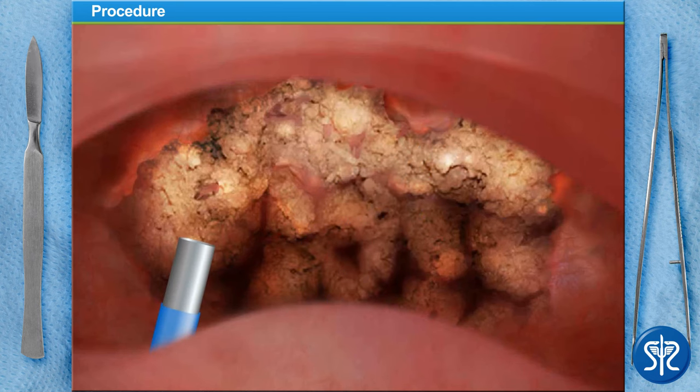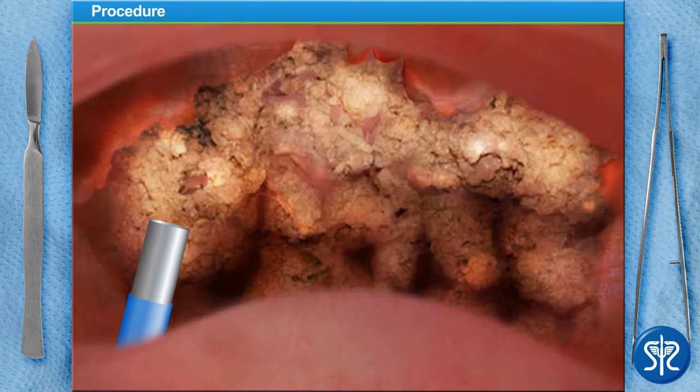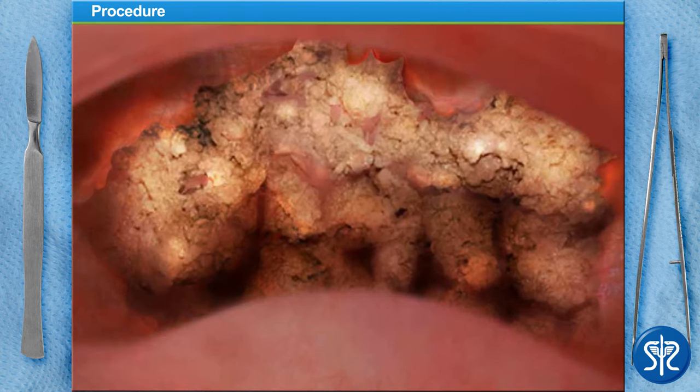The adenoids are gone. Now all we have to do is remove all of our equipment and get our patient to recovery.